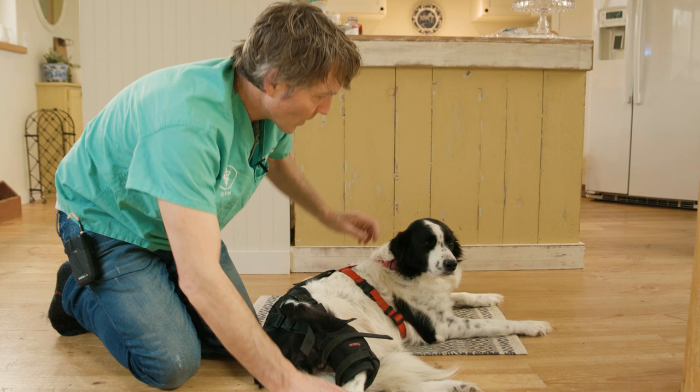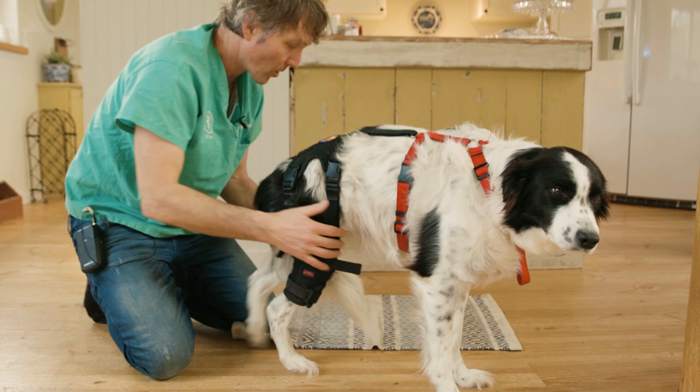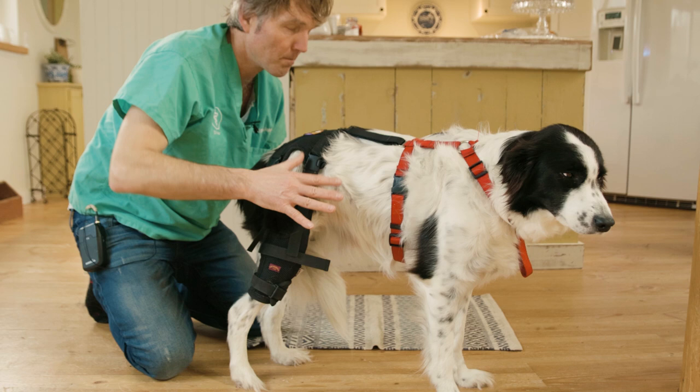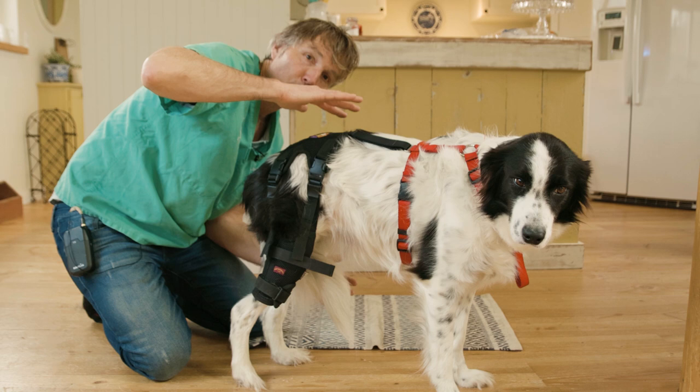Secondarily, the back support brace anchors and equalizes some of the force between her left and right knee. Many of these dogs will just put all their weight on one leg — as they're doing that, they cause their back muscles to overcompensate, go into spasm, and create completely awkward biomechanics. If you can normalize that, you can go a long way in helping your dog start to heal normally because all of a sudden the muscles aren't in spasm and they're not permanently hiked on one side.